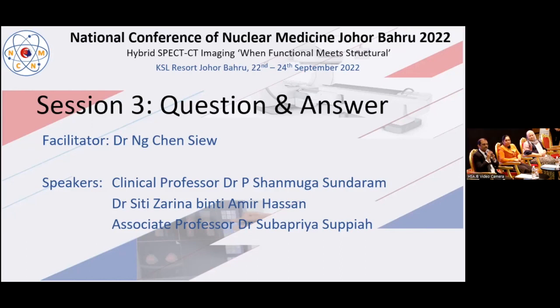I just wanted to go back to the parathyroid scan. In our department, for patients with known chronic kidney disease, we have done initial imaging and we are seeing significant uptake in the thyroid, and the patient is bedridden, so shifting the patient is difficult. Those are the times where, instead of doing multiple imaging, we already know the serum creatinine levels are high. We try to delay the images, say 3 hours, or take it after 4 hours, depending on the uptake pattern.